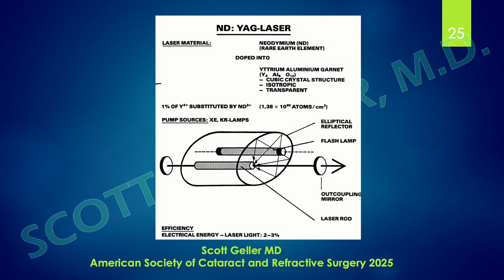Xenon lamps are the same things that you have in a flash camera, if you remember what a flash camera was. In the case of the laser I use, the crystal's housed in an ellipse-shaped reflector. It's gold-plated so it doesn't corrode.